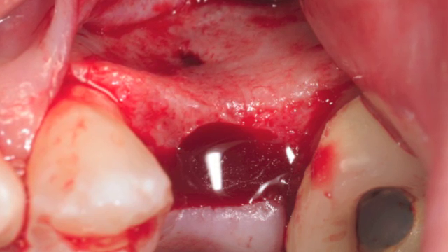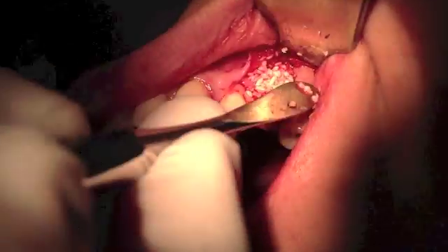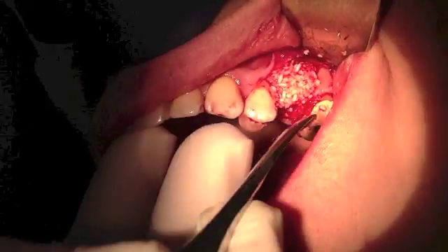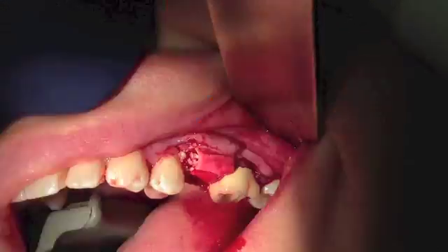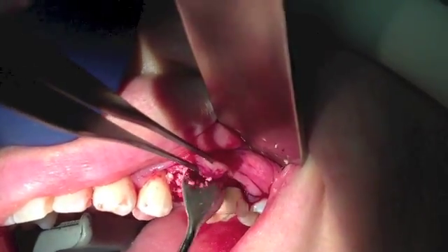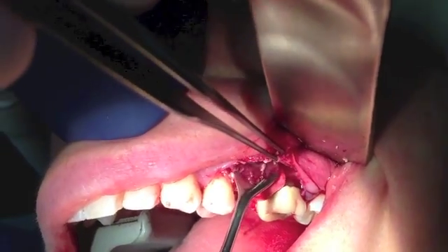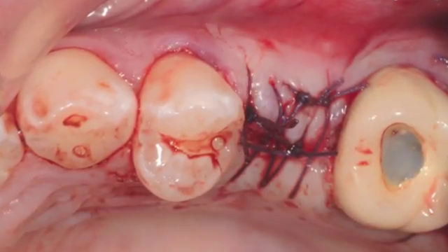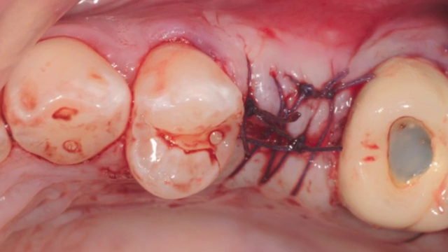Because of the buccal dehiscence and apical exposure to the sinus, this site was grafted. Initially, a small resorbable membrane was inserted into the site and pushed up superiorly to the level of the sinus floor. Next, mineralized freeze-dried bone was packed into the site, again with caution not to extend it beyond the sinus floor level. The lateral aspect was also grafted further and covered with a resorbable GTR membrane. For closure, a very small amount of periosteal scoring was necessary to release the flap and allow a tensionless closure.